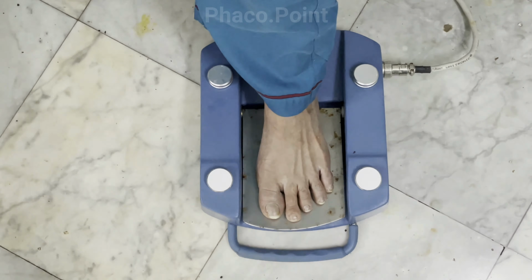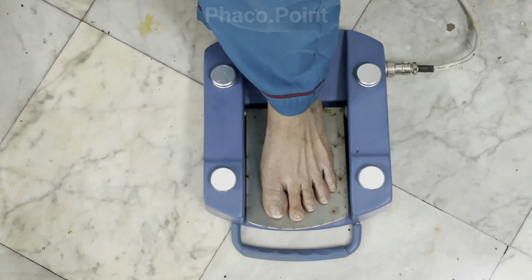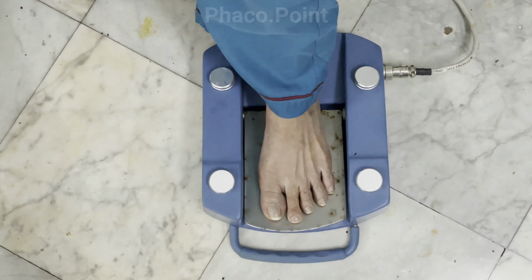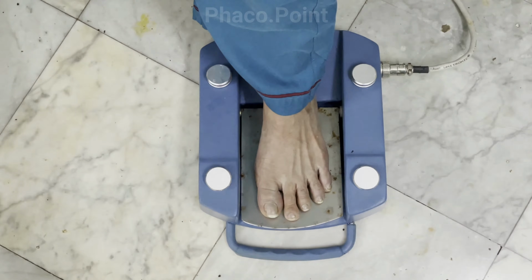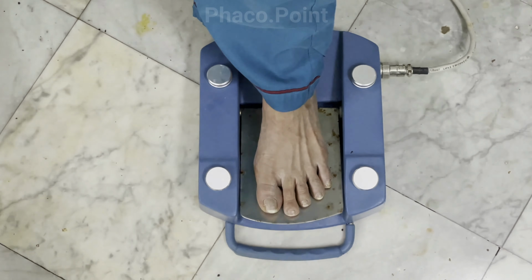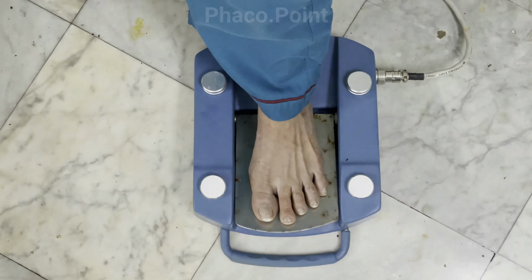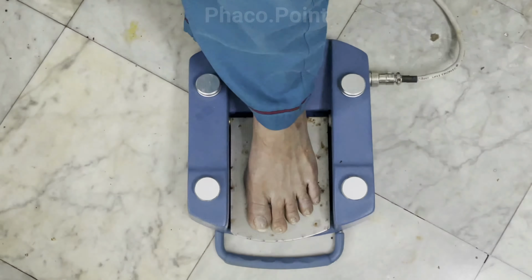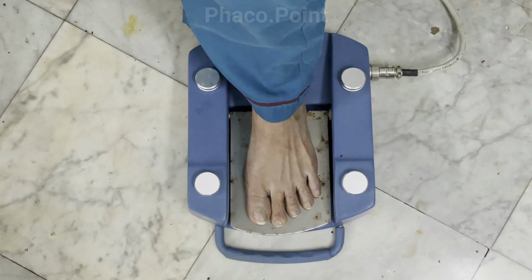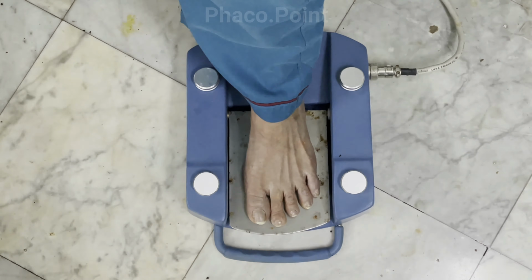Once this hold is maintained, the chopper now mechanically separates the nucleus into two halves or the fragment into smaller fragments by lateral separation of both the probe and the second instrument. Once the nucleus is separated, the foot pedal again moves to foot pedal 1. So, the foot pedal movement for direct chop is 3 to bury, 2 to hold, chop, and then the fragments are removed.